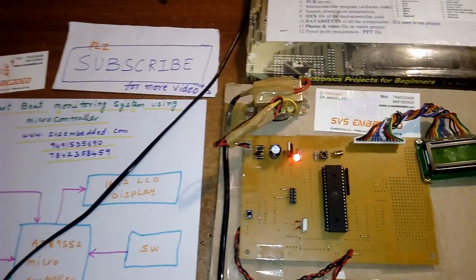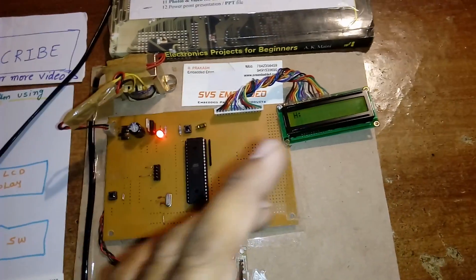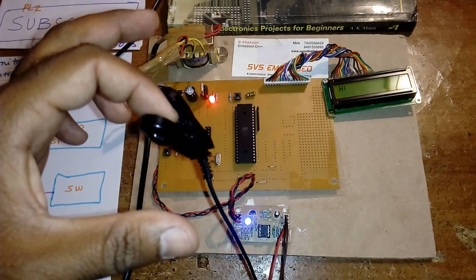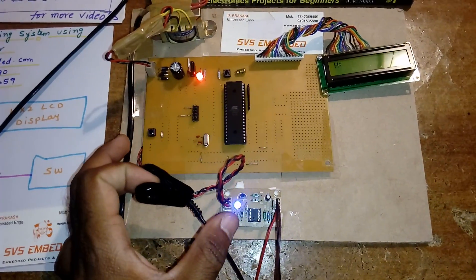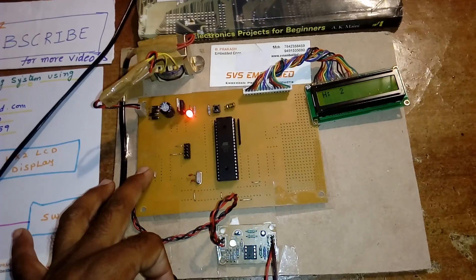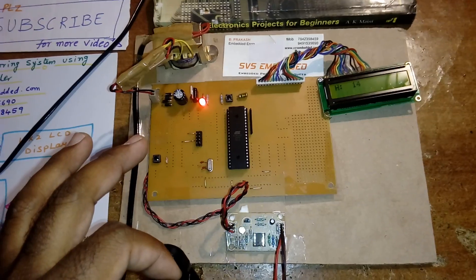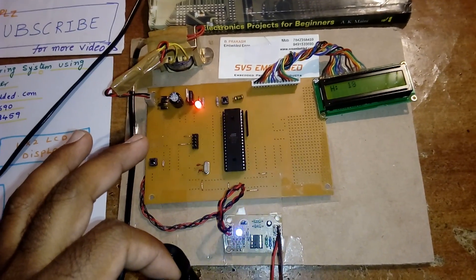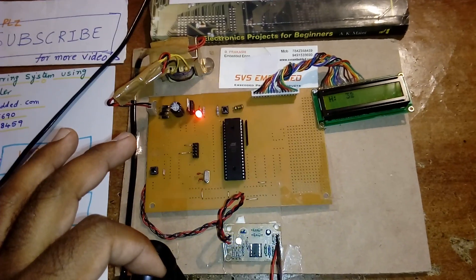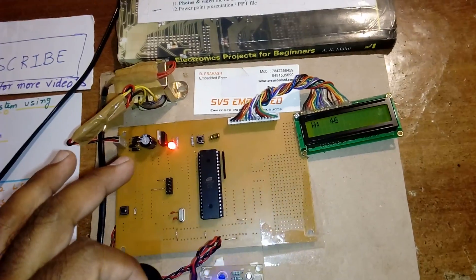This is a heartbeat monitoring using microcontroller system. It is ready to count the pulse. Whenever you want to count the pulse, first you need to take the finger clip and check whether the signal is proper or not. After the signal is proper, press the button. Once the button is pressed, it will count for one minute. In that one minute, however many pulses come, those pulses are given to the microcontroller's P3 CAP2 pin and it will display the output.